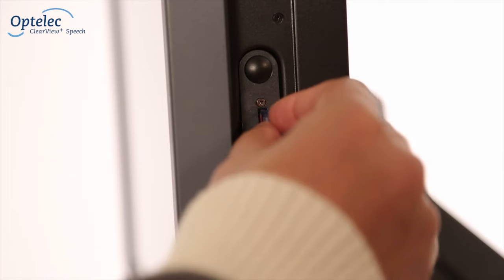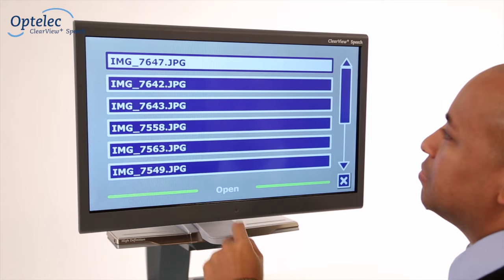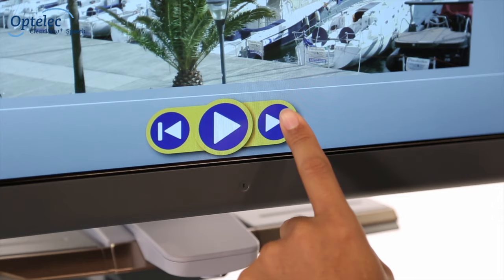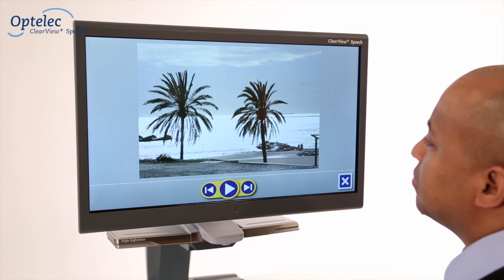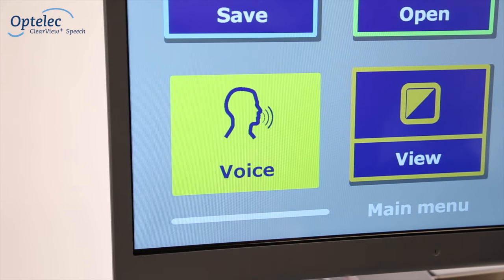You can save and open documents using an SD card or a dongle. In addition to viewing documents, the Optelec Clearview Plus Speech allows you to easily open photos. When using the Clearview Plus Speech, select the desired language and voice from the menu.